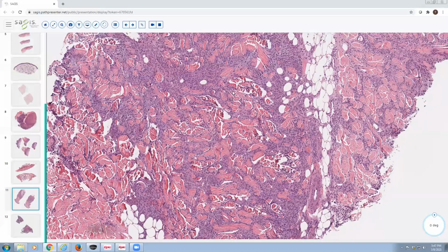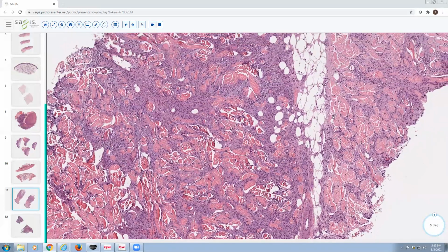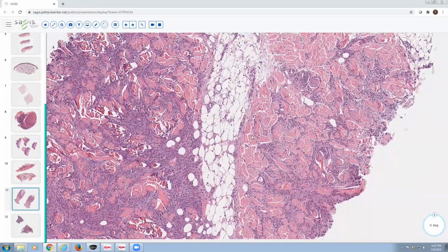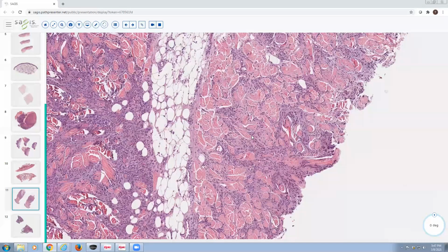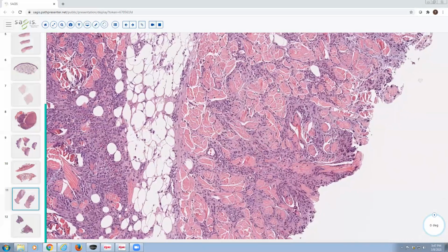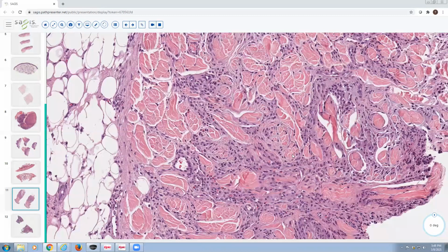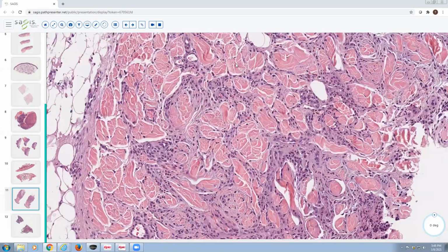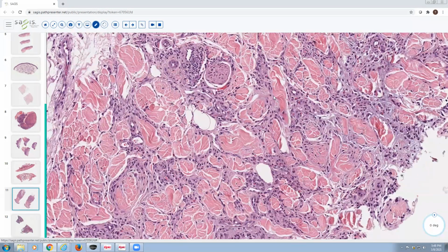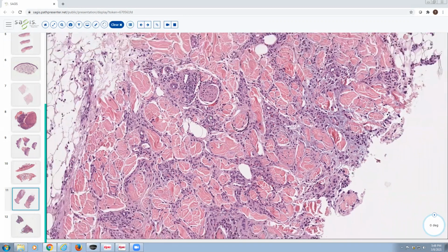And after you've identified a granulomatous infiltrate, you kind of want to decide how they are organized or arranged. In this example, the histiocytes are present between collagen bundles in little strands and what's called a rosette, which is where they surround collagen bundles, like this. They're kind of surrounding and even dissecting out collagen bundles. That's called a rosette. So it's between and around collagen bundles. That's called an interstitial pattern.